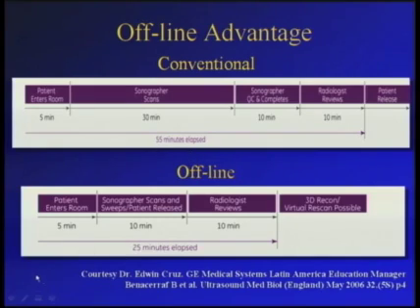It was demonstrated in different studies and trials, and Dr. Beryl Benacerraf published a very interesting paper making measurements of the time with the observation of the volumetric images of fetuses.